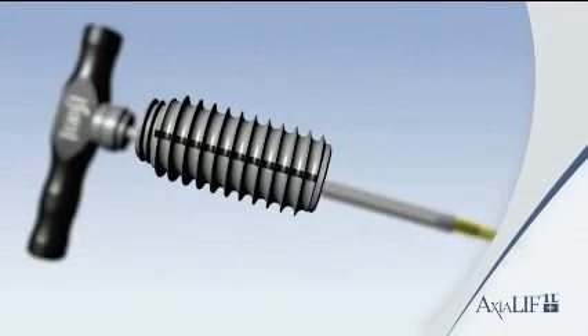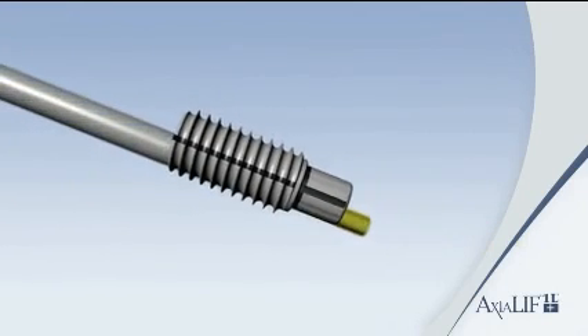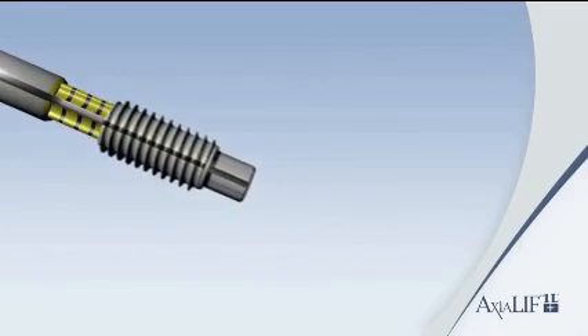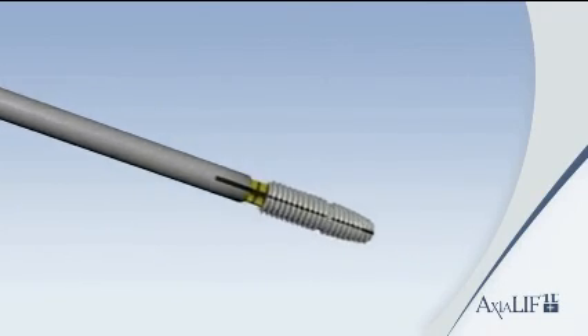Assemble the selected L5 anchor, distraction rod, and S1 anchor onto the dual driver and insert into the prepared channel simultaneously.